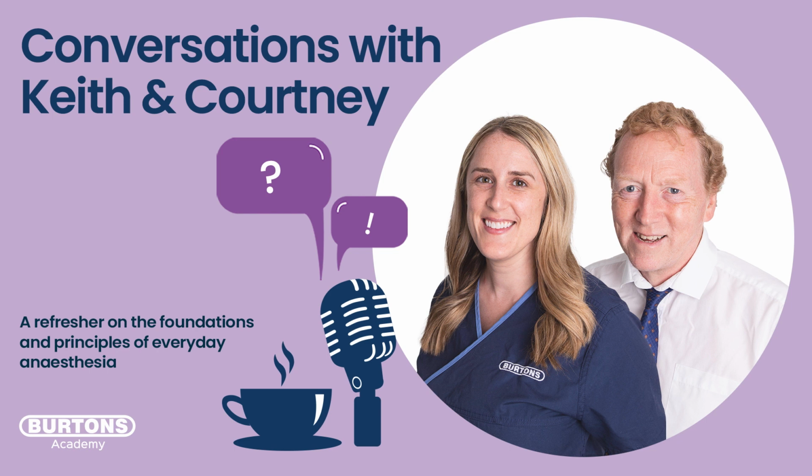That's on the left-hand control, and we'll set our expiratory time as before because it has an expiratory time control. So this is a cat, because it's got to be on an animal less than sort of 10 or 12 kilos. Let's assume it's a cat breathing at 20 breaths a minute. Therefore we need 3 seconds for the whole cycle: 1 second for inspiration and 2 seconds for expiration. So we'll set expiratory time to 2 seconds.